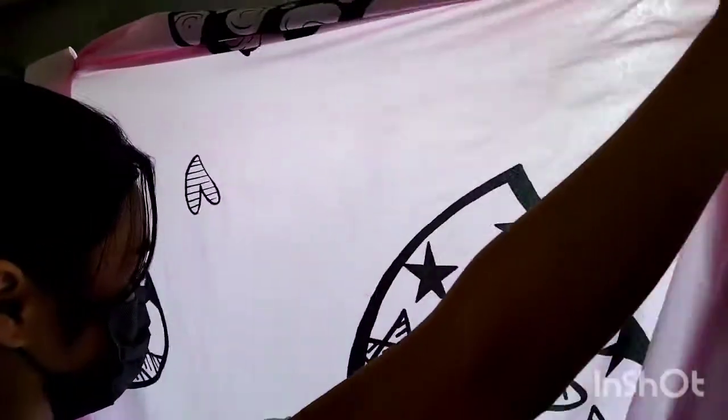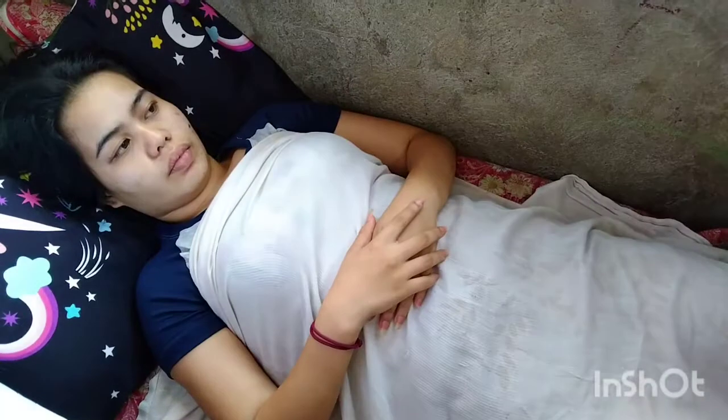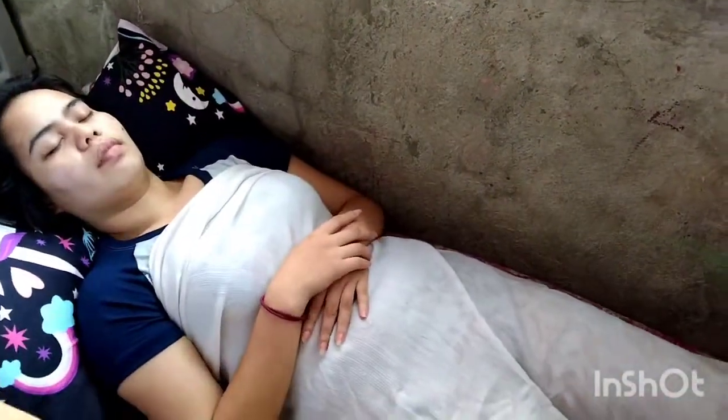Next step is to screen the patient to provide privacy. This reduces client embarrassment and aids in relaxation during the procedure. Next is to place bed in high position and lower side rails on working side. This promotes use of proper body mechanics.